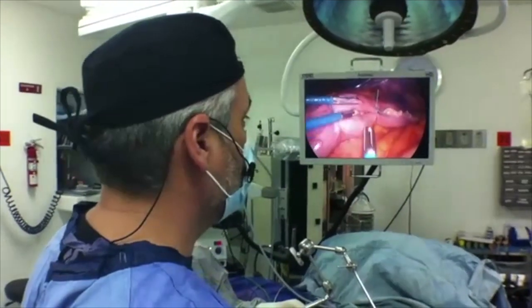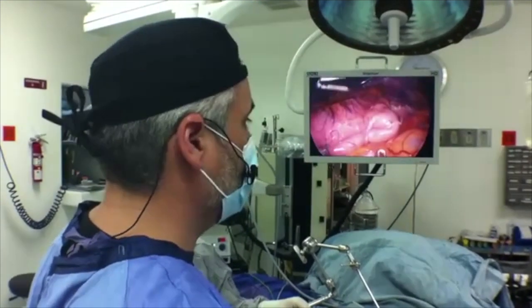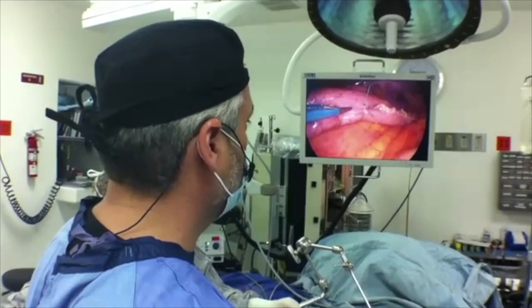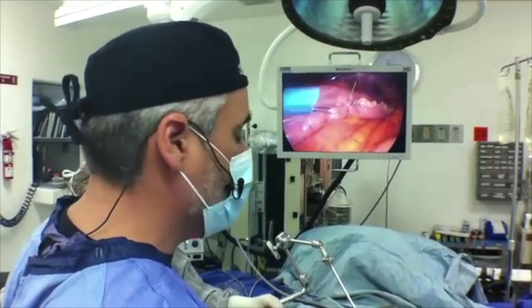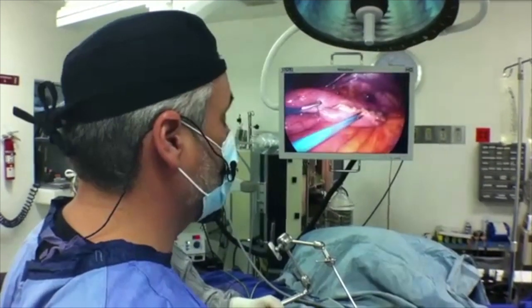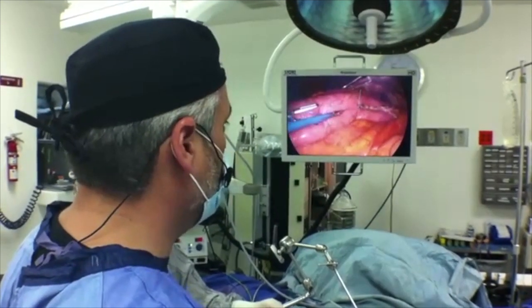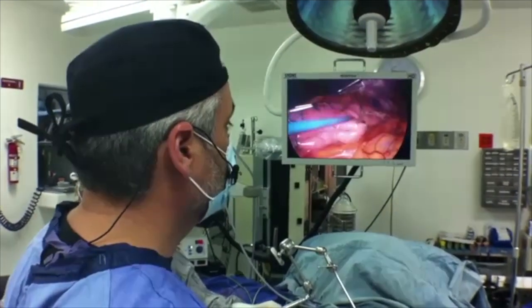This would be a herniation of the stomach through the stitches. Even if it were swollen, that's not going to cause anything. If these stitches were closer together — say about one inch apart — and this would herniate, it would cause a problem because it would cause pinching and ischemia: either venous stasis, where the drainage of blood is not flowing correctly, or ischemia where arterial blood is not feeding the tissue. Because our stitches are so far apart, if this were to happen it acts as a kind of fail-safe — nothing will be at risk.